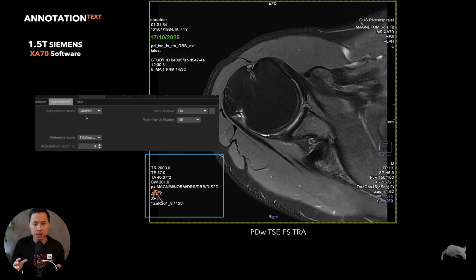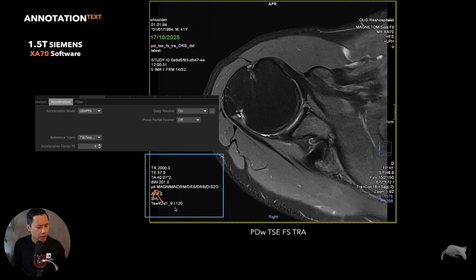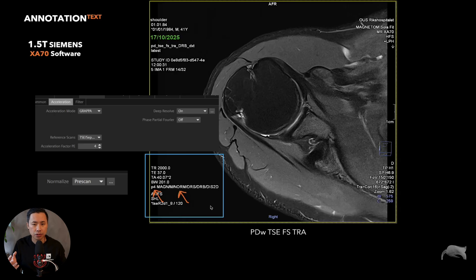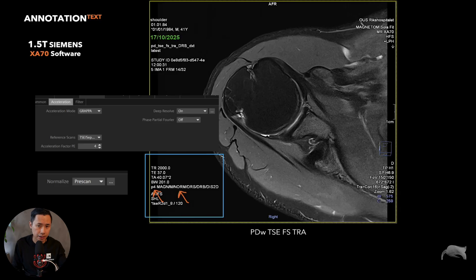The next item shows that pre-scan normalize was used. Then there is DRS and DRB - DRS stands for Deep Resolve Sharp and DRB stands for Deep Resolve Boost. In the filter card you can tick on or tick off if you want to use Sharp and Boost. In this setting I used both of them, which is why it says that.